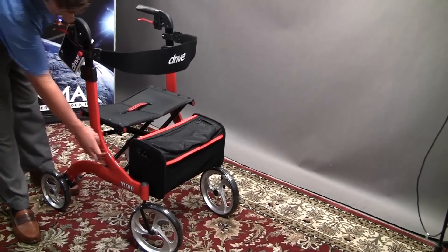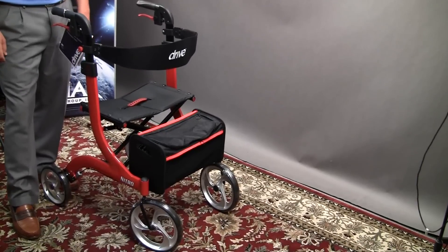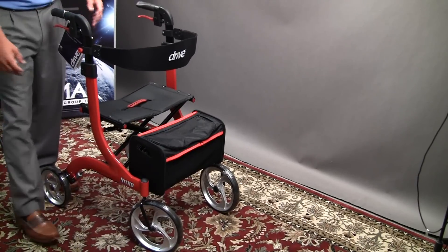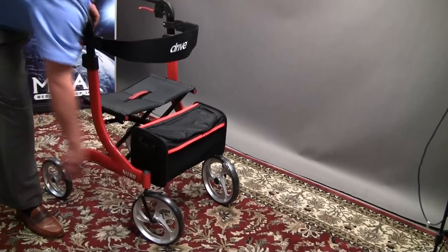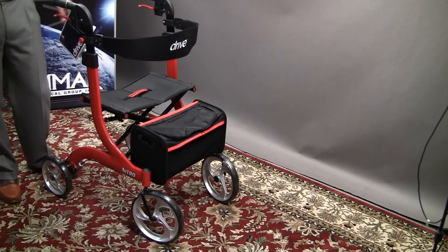The brake cables are actually encased in the frame, so they're not hanging out and flopping around open to be grabbed by any doors. It's got large front casters that allow it to easily maneuver over all kinds of different terrain and over thresholds.